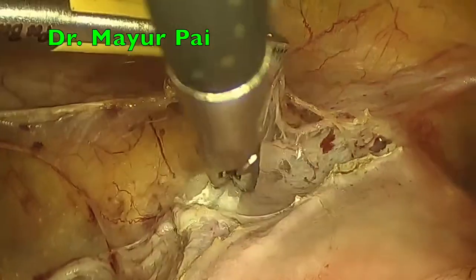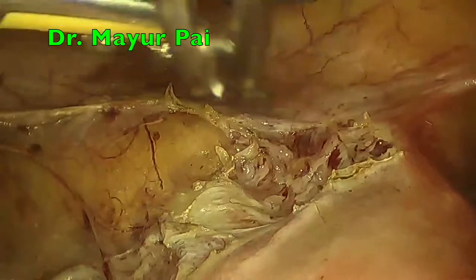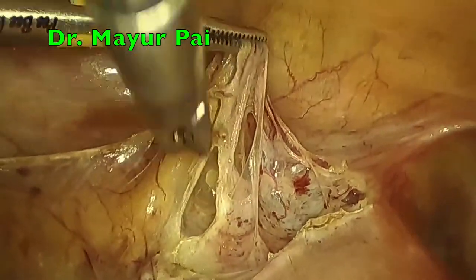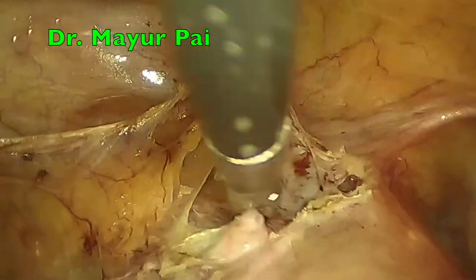This procedure may as well be done with a bipolar and scissor combination, or with a harmonic scalpel or any other ultrasound based instruments. However, this instrument, as you can see on the screen, does the job quite well.